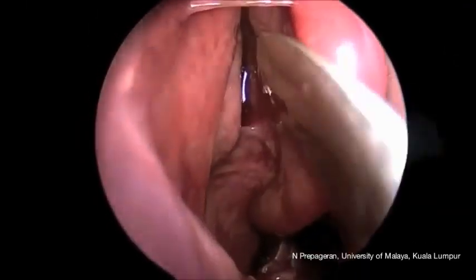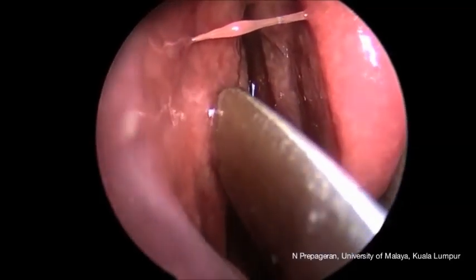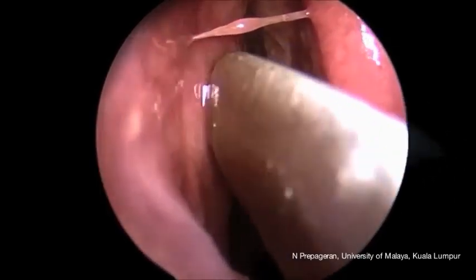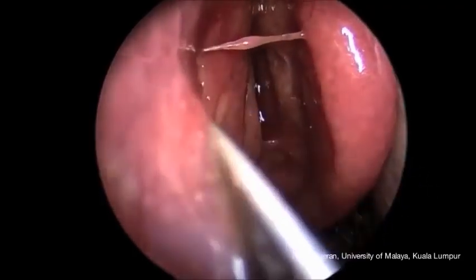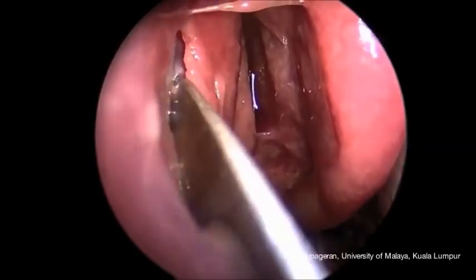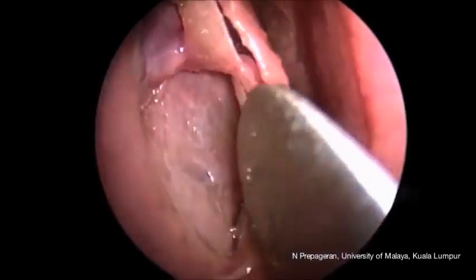Let's dissect the uncinate process now. This is the middle meatus. And again, you can just see the attachment of the uncinate process by looking at the uncinate. And you can see where it is attached laterally into the medial wall of the maxilla. Then you can put in your Freer's elevator, and in this case I'm going to try to dissect to show you the anatomy of the mucosa and the bone in between.